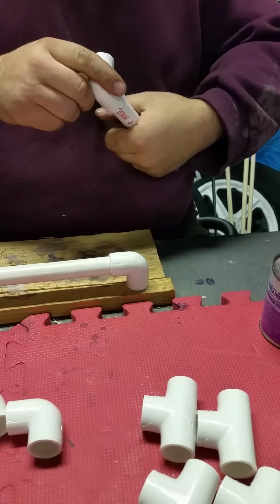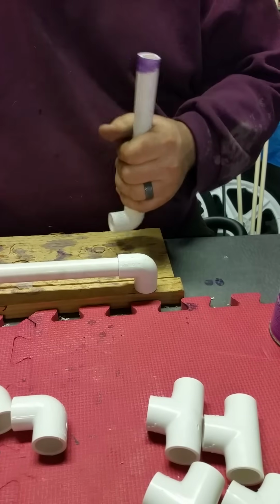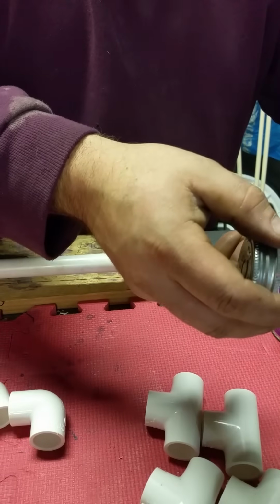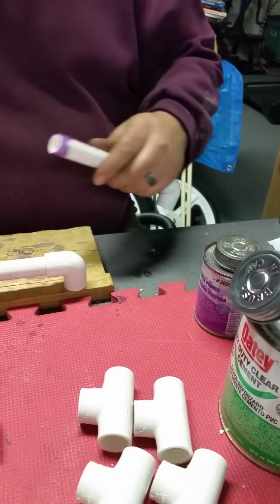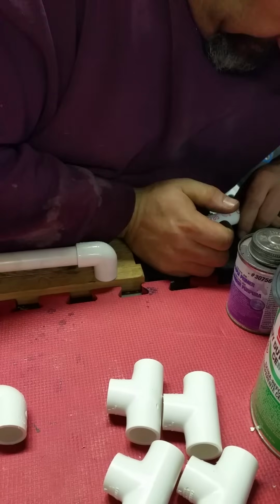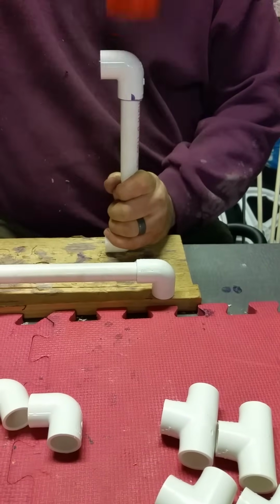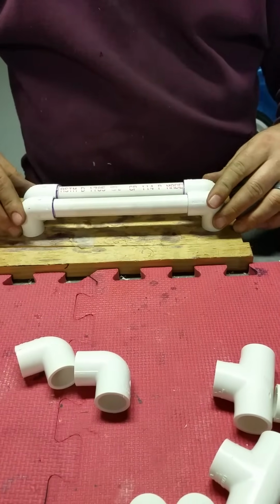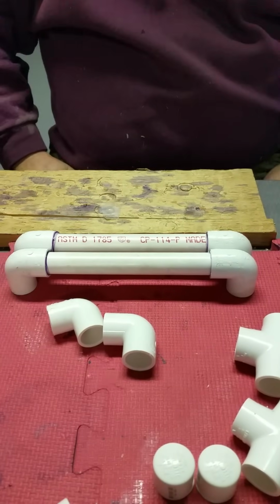So this one is for the belly bar. They're interchangeable. After they're straight, you can use the mallet to pound it down in there, but you want to make sure you don't turn anything when you're hitting it.